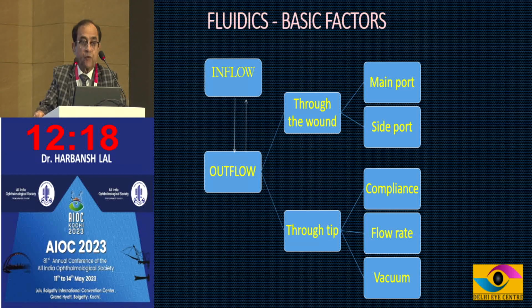So now we come to the fluidics. The basics: there is inflow and outflow. Outflow may be through the wound or through the tip. Through the wound it may be from the main port and a side port, and through the tip it depends upon the compliance of the system, flow rate and vacuum.